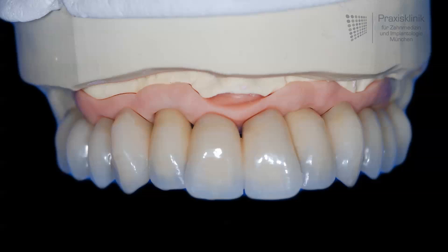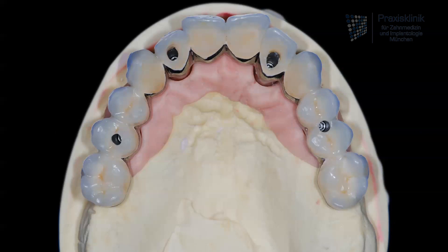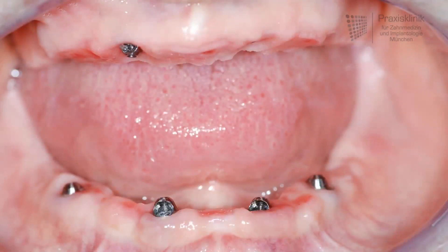Large restorations like in this case are screw retained to ensure that there is a possibility to remove this kind of prosthetic if there are any problems with the implants. Here we can see the four screw access holes. In the intraoral view we can see the connecting components passing through the gum. These are the so-called multi-unit abutments which are the anchor points for fixating the full arch bridge onto the implants.